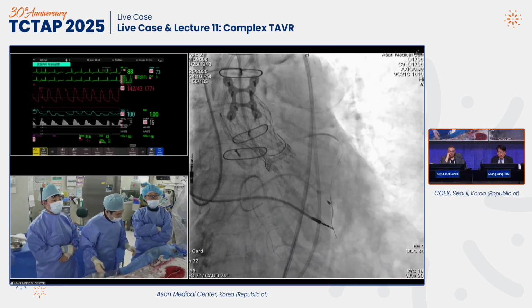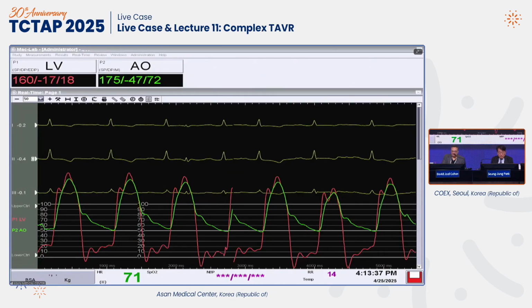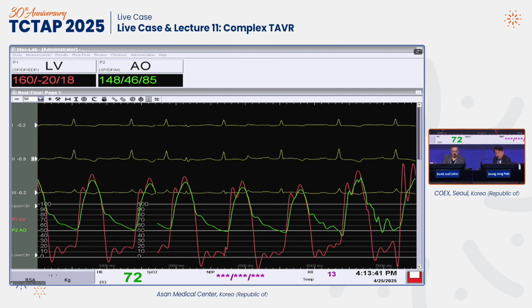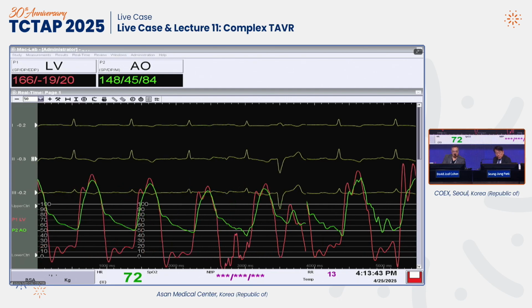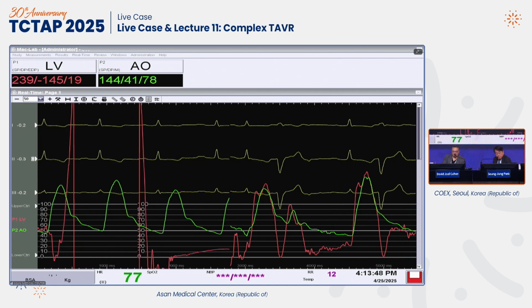No matter what, flush again. It's not going to look the way you want it. So I think that's for sure. Now, we will do flushing. Gradient's pretty good. I think it's good enough, pressure. Right? Yeah. Small difference. Flush a bit more. No air. Okay, and then that's done.